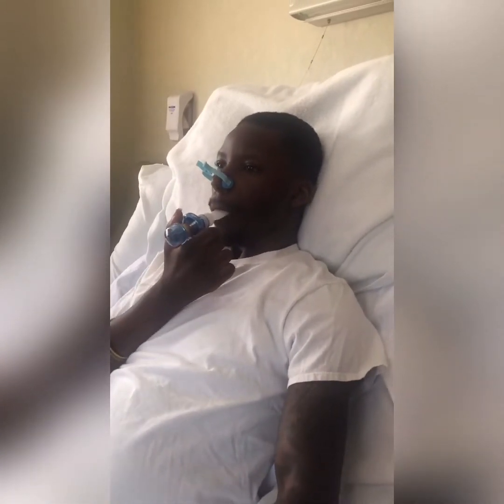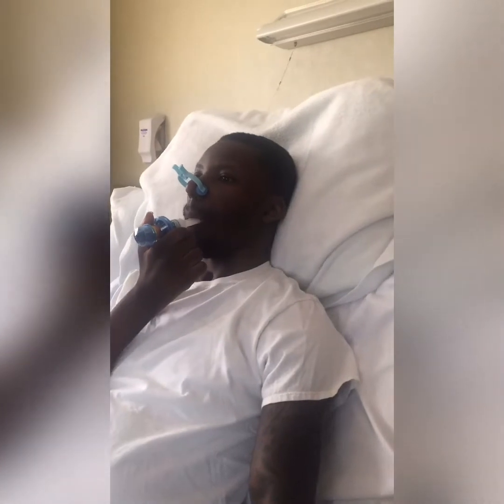We are in a testing mode right now. We're just trying to figure out at what level he can get the best exhale. So we have so far moved up. We started at 30, just for your information. We've moved up 2 levels so far. We're going to keep going until it gets feeling kind of difficult, and then we are going to do a week of training at that level.